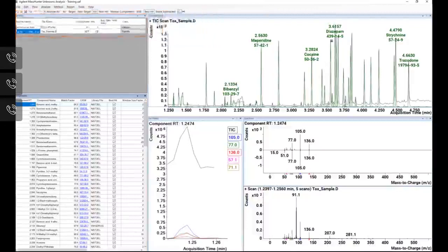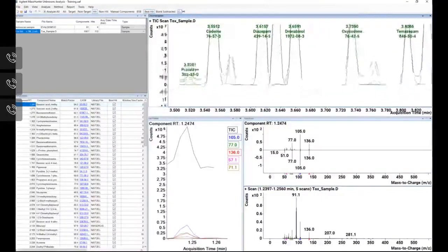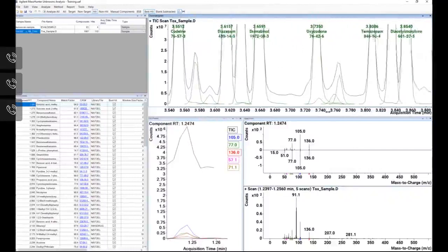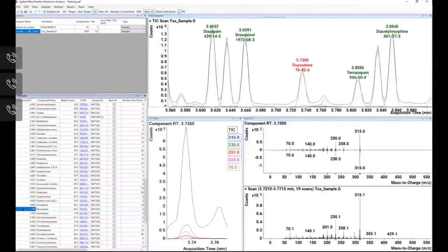doing peak integration. And I'm going to purposely zoom in between that 3.5 and 3.7, look specifically at my oxycodone. We all should know how to do this now. I'm right-clicking and dragging on my y-axis, and I'm going to left-click and drag on my x-axis. Notice if we now go in our table and we highlight, was it 3.7 oxycodone? Well, it just rescaled everything for the oxy. The oxy is in red, and then the tick is in black.